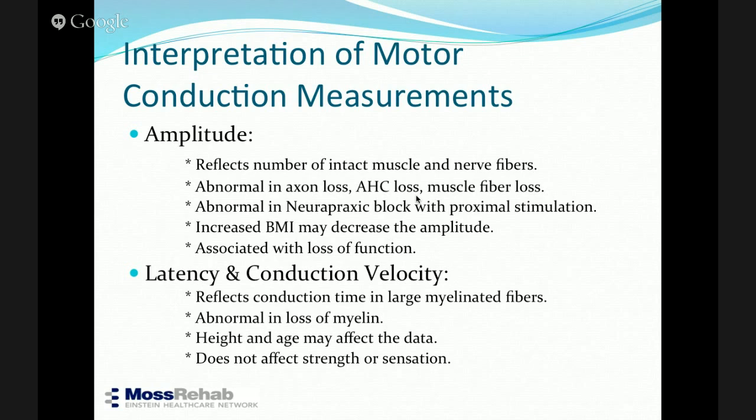We had that the other day. Right? When you're stimulating, you had it in the ground, like in the EMG port, not in the black or the active port. So your amplitude, instead of 10 millivolts, was 1 millivolt. And you start looking at it, and you haven't noticed that. So why is it, as I'm stimulating, that it's not increasing in amplitude? The patient has normal strength. So you go back, look at the machine, there's a problem. Or you may be stimulating in the wrong area. You may be not on the right point of recording. All of that will change the amplitude. So you have to be very careful.